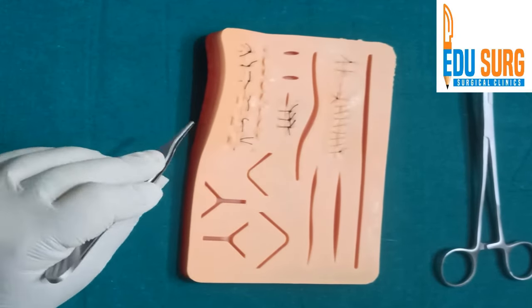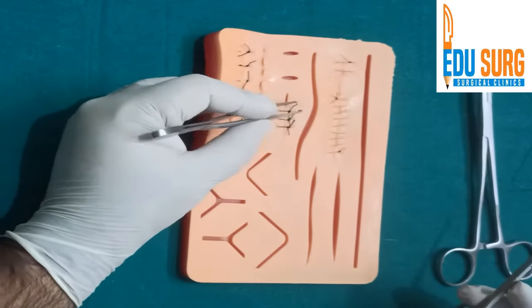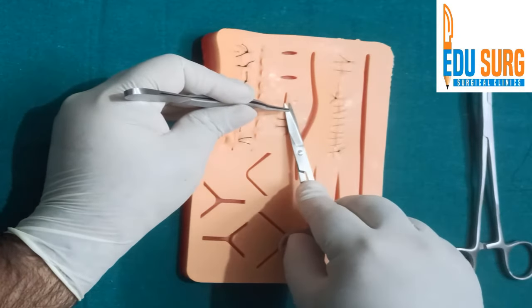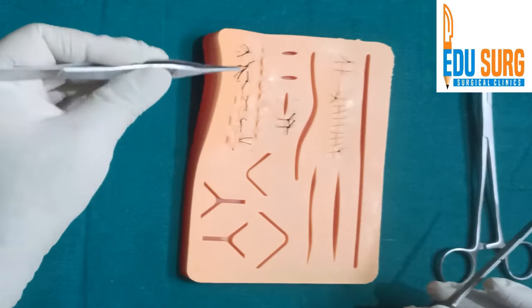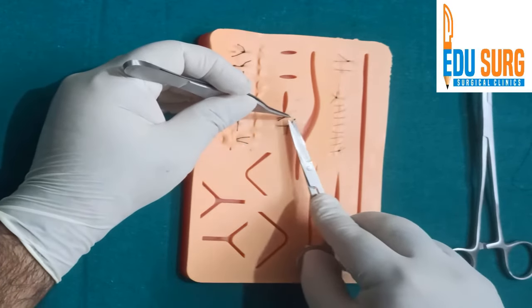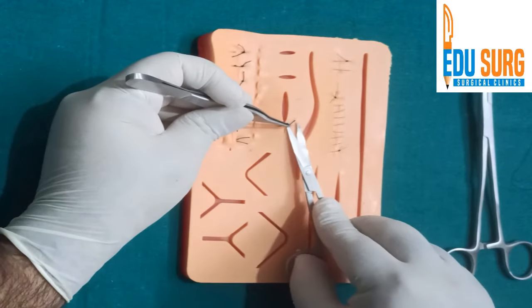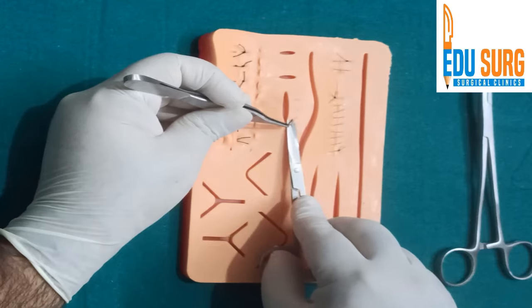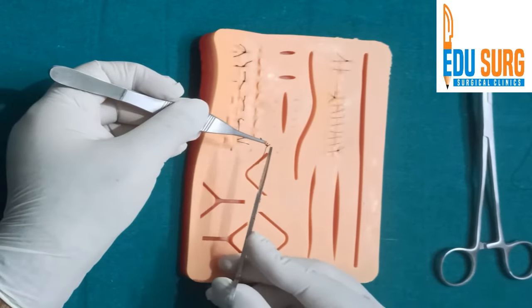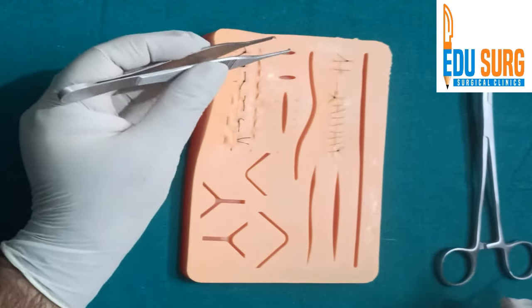Otherwise the risk is suture granuloma. So this is how you remove a stitch. Once you see the inside part, cut it and pull it out. Hold, pull, cut and remove — but don't pull very hard because the patient can have pain. Check: one, two, three, four. That is how you remove simple interrupted stitches.